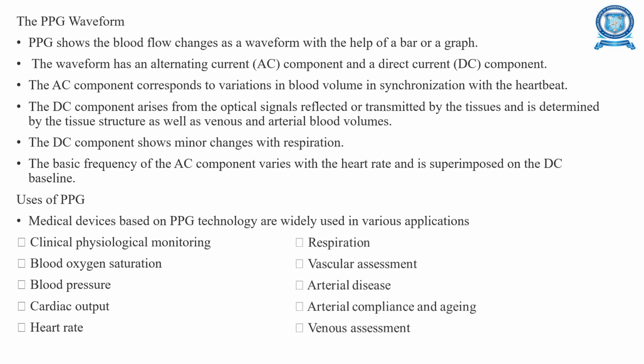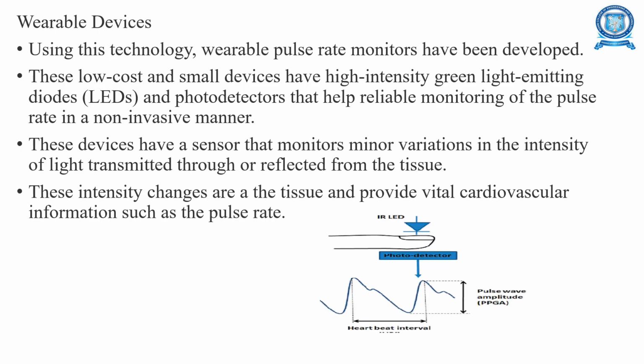The main uses of photoplethysmography are clinical physiological monitoring, blood oxygen saturation, blood pressure, cardiac output, heart rate, respiration, vascular assessment, arterial diseases, venous assessment, arterial compliance and aging.